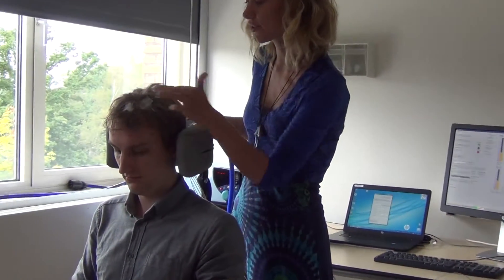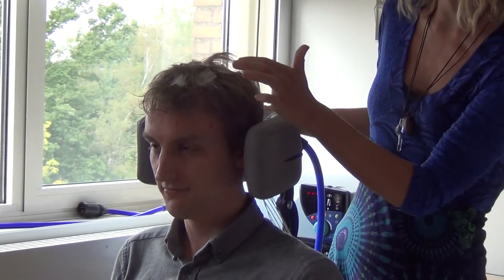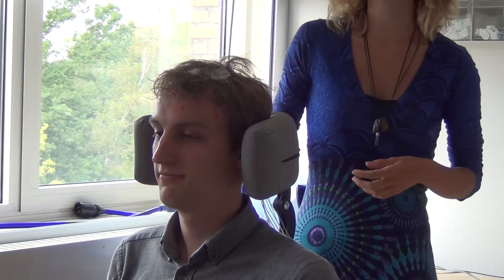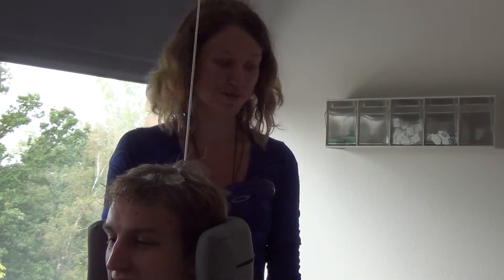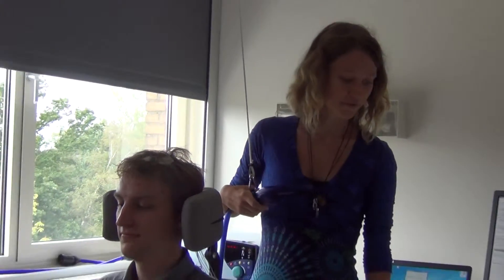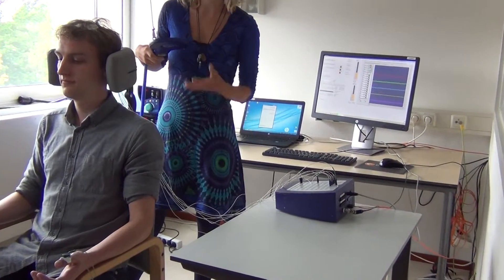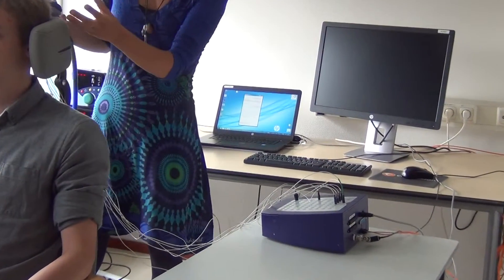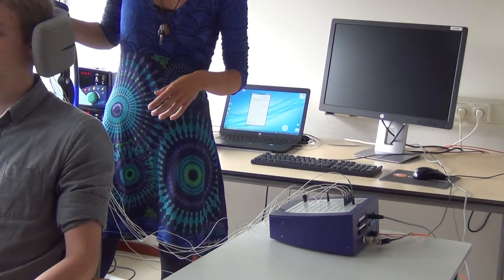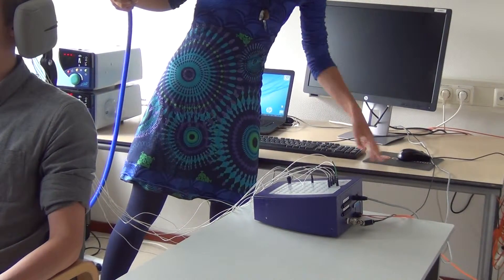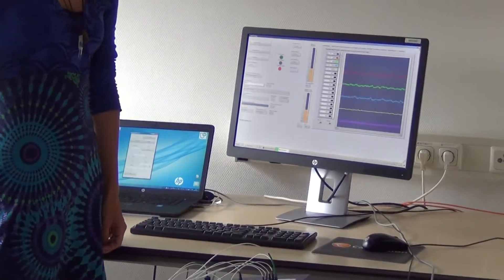Stefan has five electrodes on his head: Cz, CP1, CP2, FC1, and FC2, plus a reference electrode — only for demonstration, because normally we use 64 electrodes, but for demo purposes that was too many. The electrodes go to a special amplifier that can be used for TMS stimulation, because TMS induces currents in the electrodes, producing large artifacts, so you need this special amplifier.